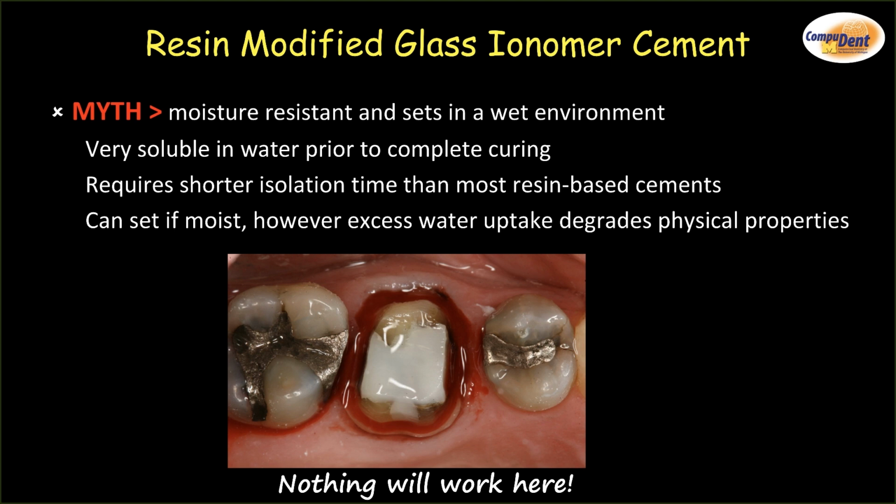Isolate the area you're going to, have a clean tooth, have a clean crown, mix the cement, put it in place, hold it for the specified period of time, and clean it up. You only have a couple things to keep right there. And so that's a great way to work. Just don't fall into the trap. Yeah, but it overcomes this kind of a limitation.